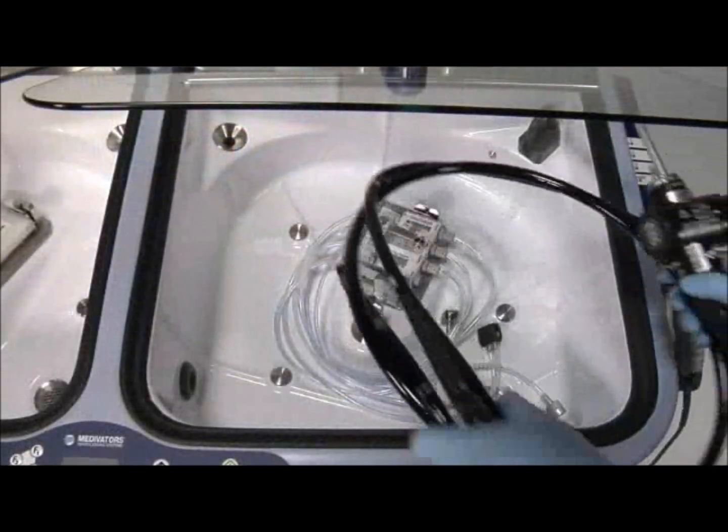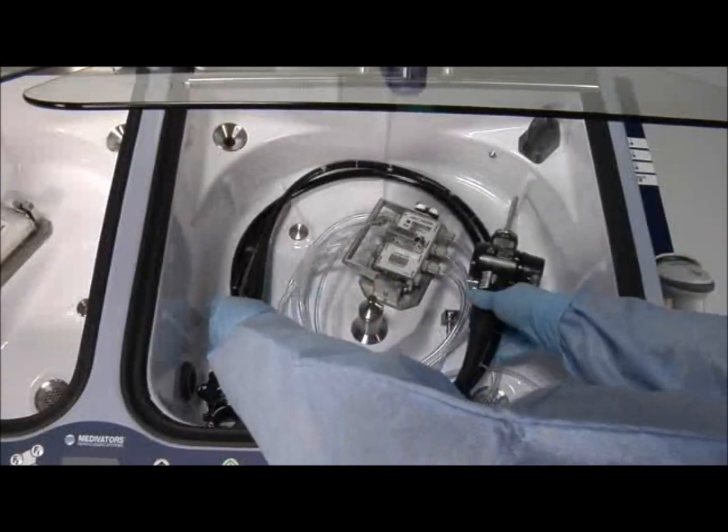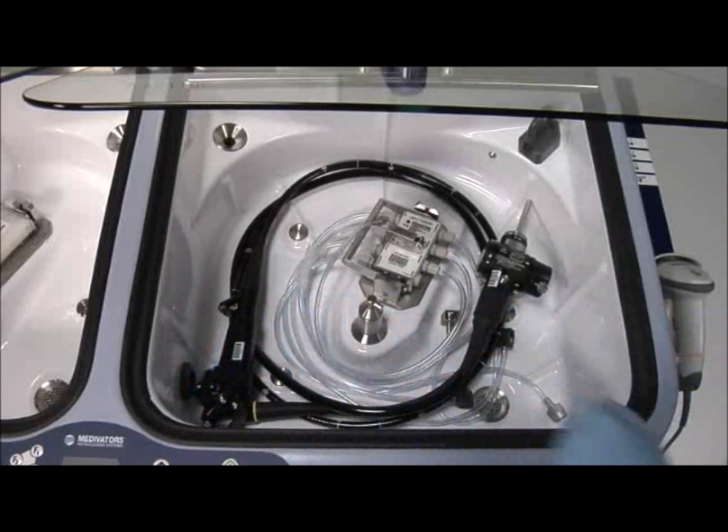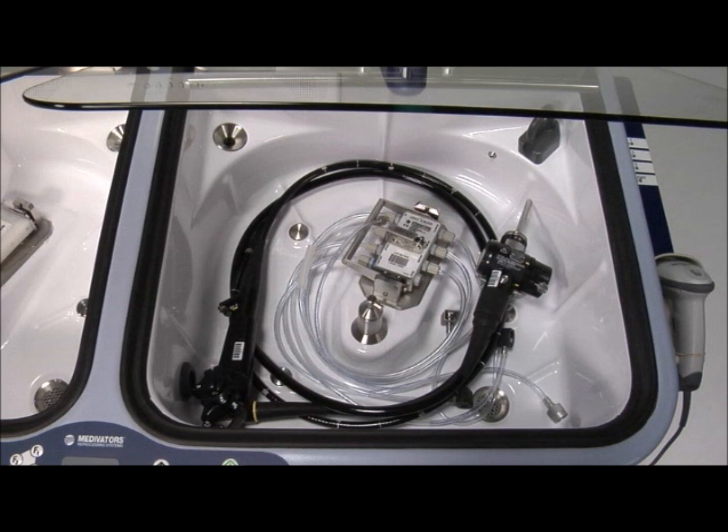Put the endoscope in the basin. Place the control section in the lower left corner of the basin and the light guide connector at the right middle. The distal end should be positioned so that fluids passing through it into the basin will be clearly visible.